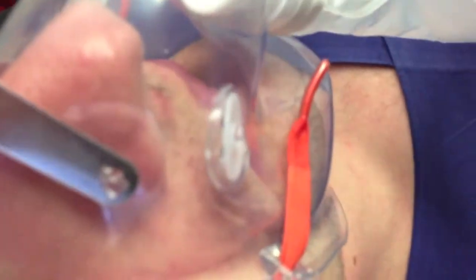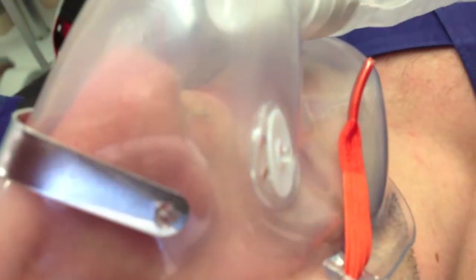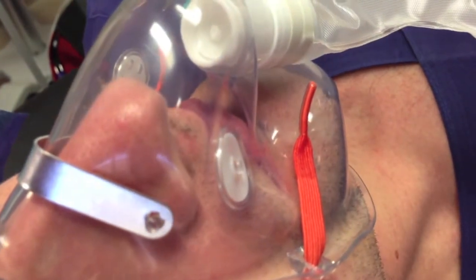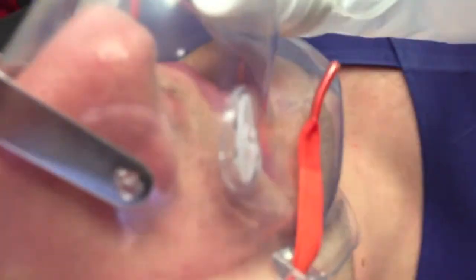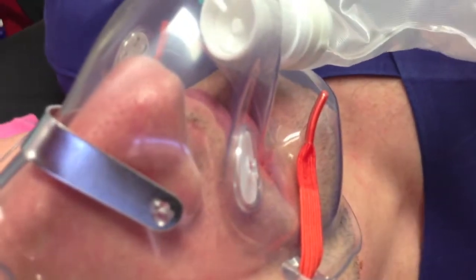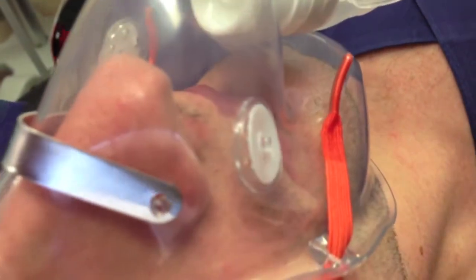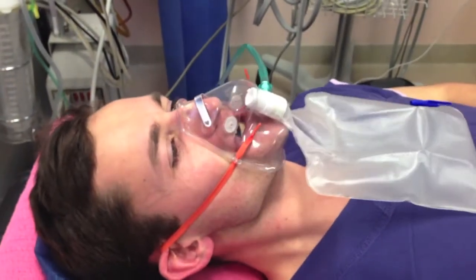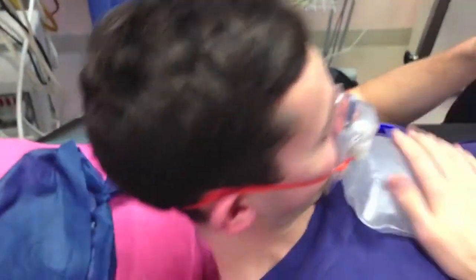As minute ventilation is further increased, however, the closure of the ventilation port valves in combination with higher inspiratory flow rates leads to a negative pressure developing inside the mask during inspiration. Unlike the bag valve mask devices, the non-rebreather mask does not have valves which allow entrainment of room air when the inspiratory flow exceeds the capacity of the fresh oxygen supply and the reservoir bag to deliver high concentration oxygen. Thus, once inspiratory flow outstrips the oxygen supply, without the ventilation ports to make up the excess gas flow, the device collapses, causing acute transient airway obstruction and preventing further inspiration.